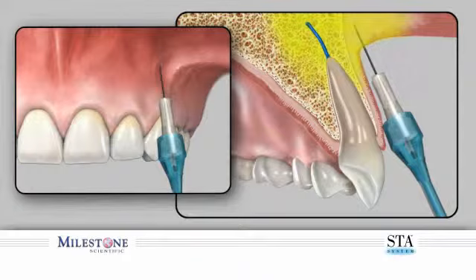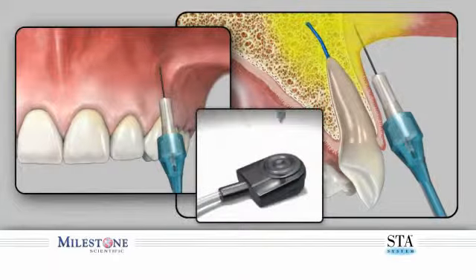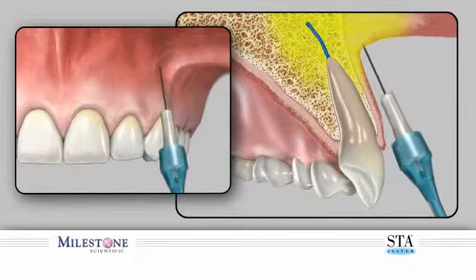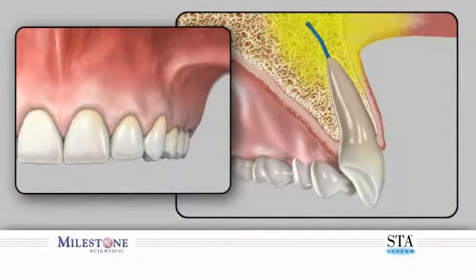To avoid anesthetic solution spray back into the patient's mouth, perform the following. While the needle is still embedded in patient tissues, depress and release the foot control pedal. Count 3 beeps after releasing the foot control and then remove the needle from within the patient's mouth. Direct the needle away from the patient as a small amount of anesthetic solution may still be present. Should you require more than one anesthetic cartridge, you can reload subsequent cartridges and continue as required. Please see the section on multi-cartridge technique.